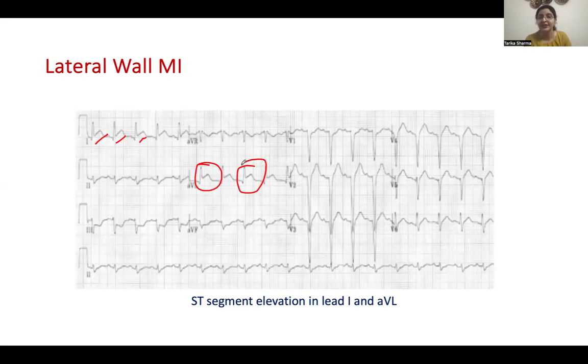I know that it is a bit confusing, but when you go to clinicals and you observe the ECG strip, then you'll be able to find out, yes, I have told you something like that, and let's try to explore whether it is present or not. Many times the patient might be having a combination of defects present in the ECG.